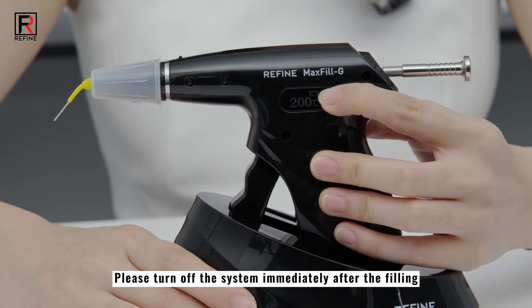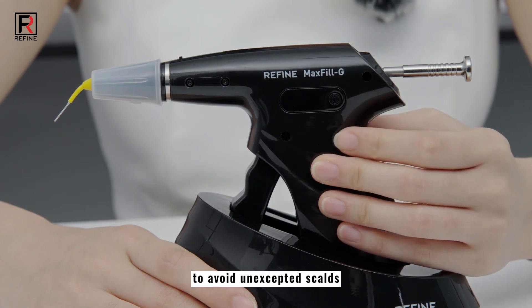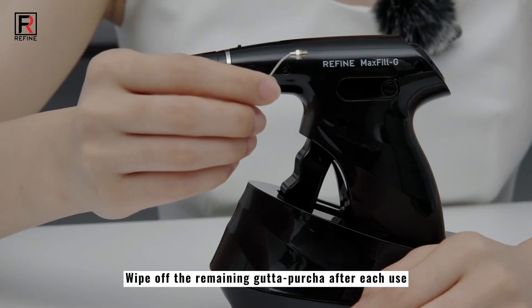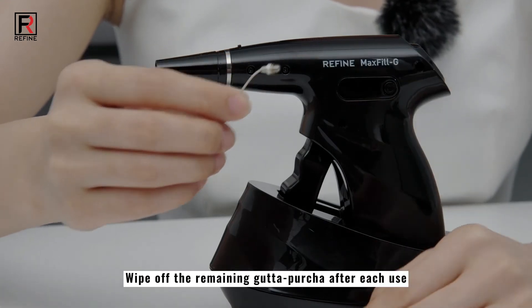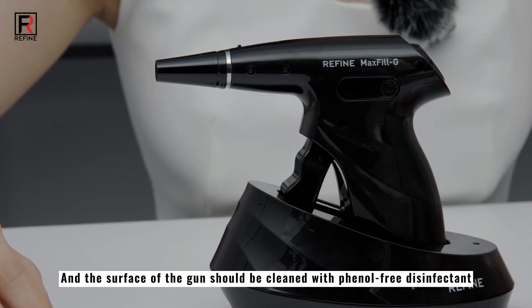Please turn off the system immediately after the filling to avoid scalds. In the meantime, this can also prolong the battery life. Wipe off the remaining gutta percha after each use.